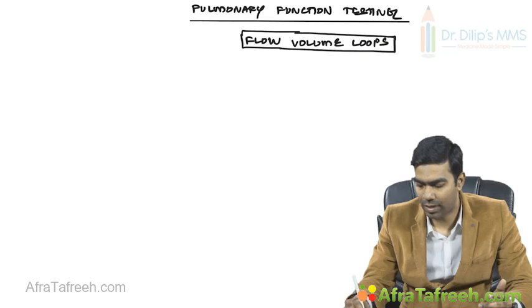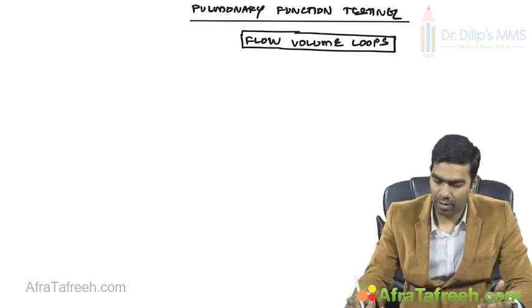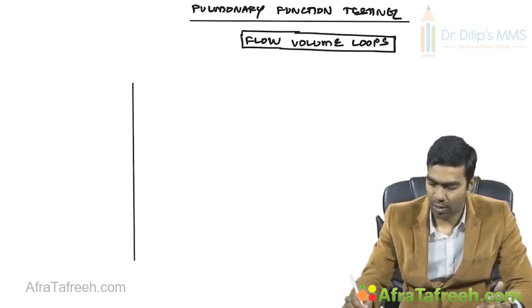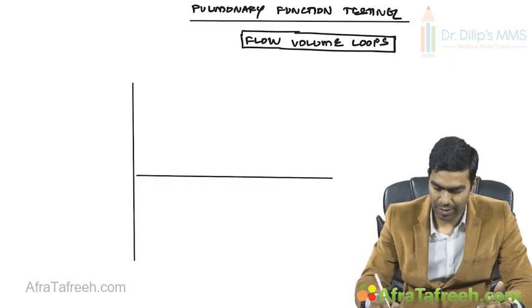So what is a flow volume loop? A flow volume loop is one where your volume in PFT is actually plotted against the flow. Let us see how to plot that. So again, stay with me and draw with me. So let us see how a flow volume loop is going to look.